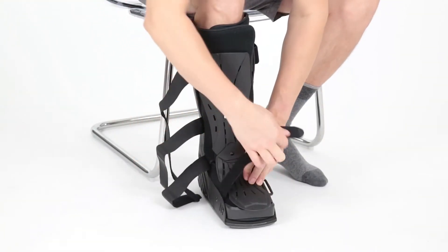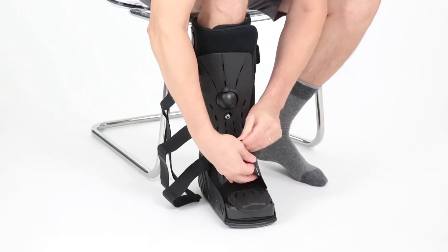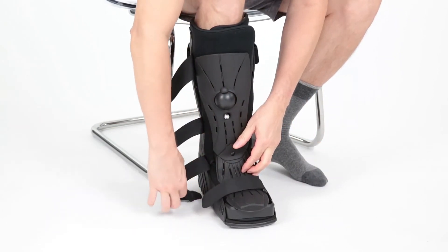Secure the outer straps from bottom to top and tighten to a comfortable fit. Do not over tighten.